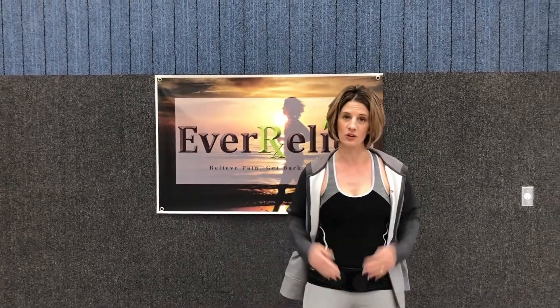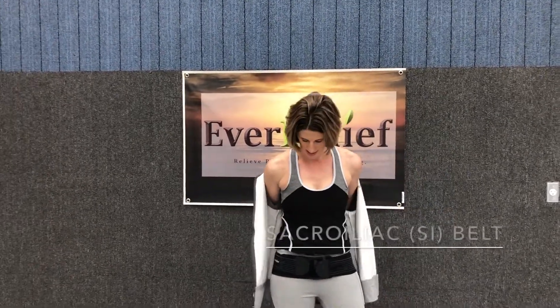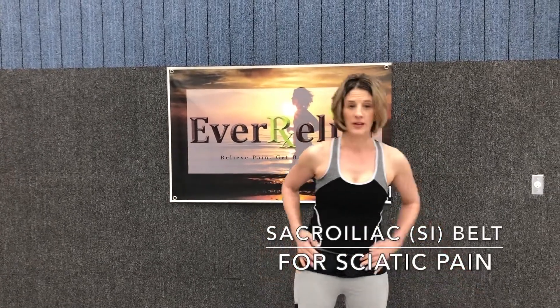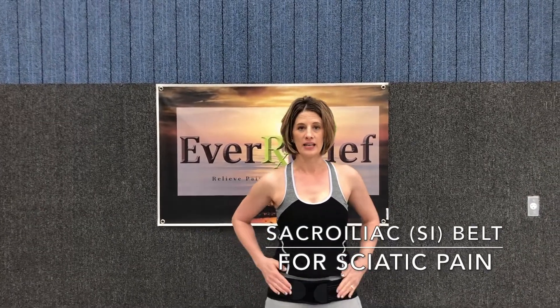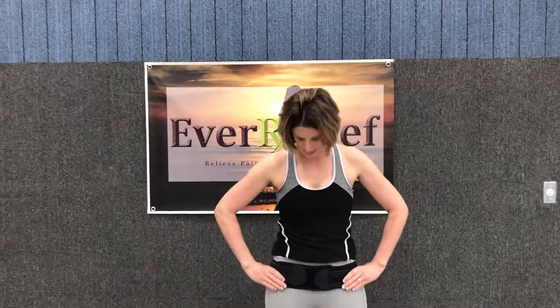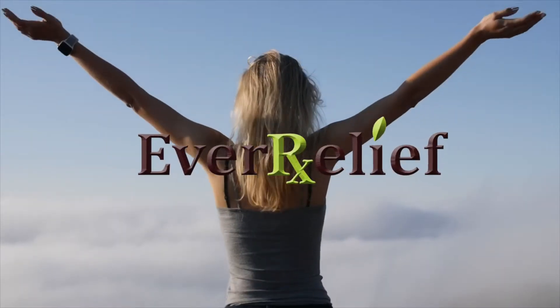So that's our sacroiliac belt — for people that have problems with sciatica symptoms, low back pain, or any issues with their pelvis area and joints in their hips. It's going to stabilize and compress that area and reduce a lot of the pain you're going to feel in your low back. We have it available in a medium or a large size. Thank you.